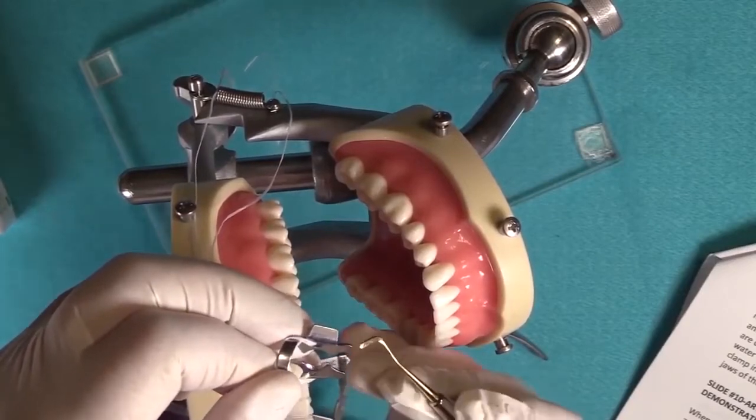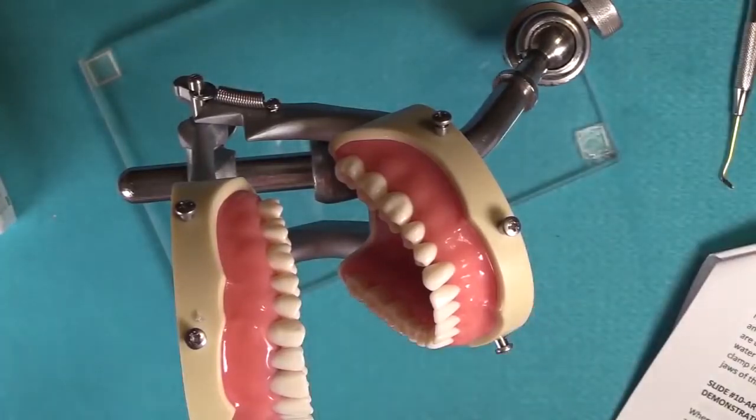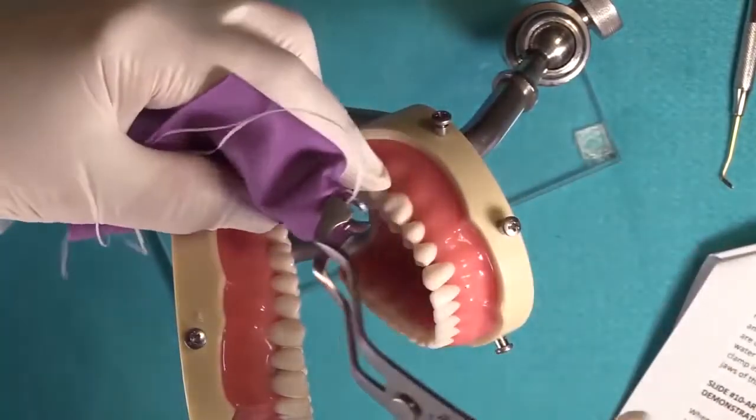That probably wouldn't interfere. But definitely the wingless clamp would be your choice when you have a class 2 and you're using matrix systems. But this technique, the modified wing technique, is an easy way to apply your clamp.